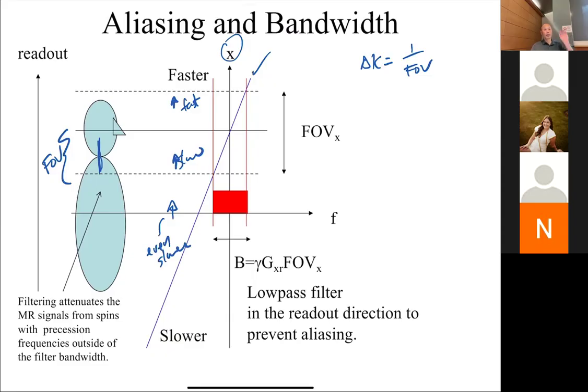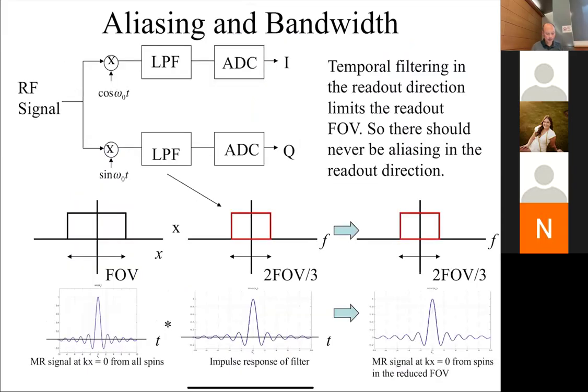Okay, and they're actually processed at an even lower frequency. And therefore, since I know the MR signal is coming in as a frequency signal, I have an opportunity to say, well, let me just not look at those frequencies. They're outside my range, so I'm just going to filter them out. And that's in fact the job that this low pass filter does.